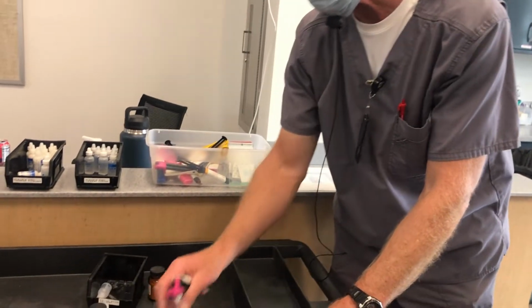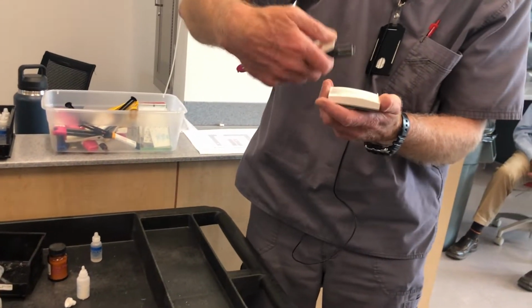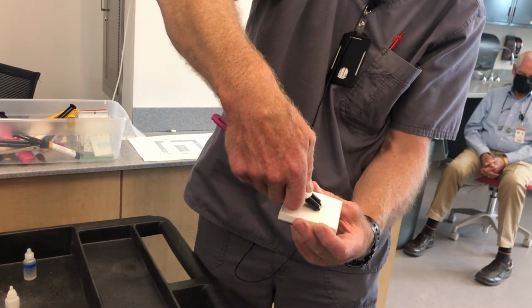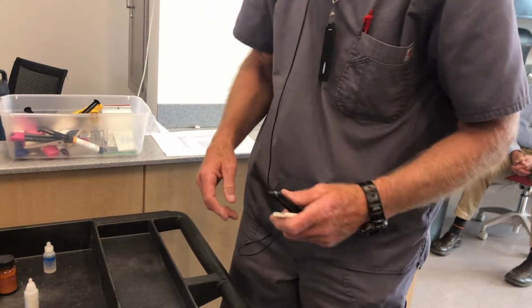If somebody wants to practice with this, let's dispense a little. This is a clicker, and this one may be getting a little old because we only use this about once a year upstairs. But you click to dispense. Oh, we got a plugged barrel. See that? So that's because, again, these are not used very often.